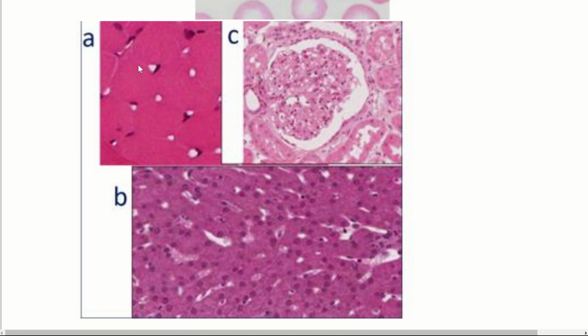Okay, so this is a depiction of skeletal muscle, and then here all these little gaps are going to be those capillaries, and remember, those are continuous capillaries in your skeletal muscle, because we do not want blood running freely throughout here, okay, because that would mess up their contraction and get in the way of things. B right here, this is in the liver. We'll cover liver after your midterm, but the liver filters your blood, right? So it needs a lot of blood, and it needs to get in contact with whole blood so that the cells in the liver can filter it, okay?